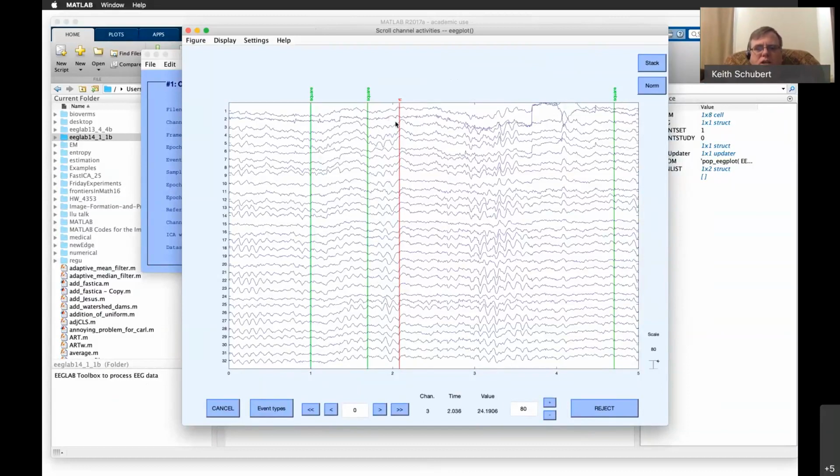Now, from all of these channels, we'll have to find out where they're located and things like that. You'll notice these channels are just numbered, no fancy thing to them. So when we go to localization, we're going to have to rely upon them supplying us a map. If these channels had more intelligent names other than just numbers, then we could use a standard mapping. So we can see all these. We see some weird artifacts that are also in here. We see these jump discontinuities that go on.